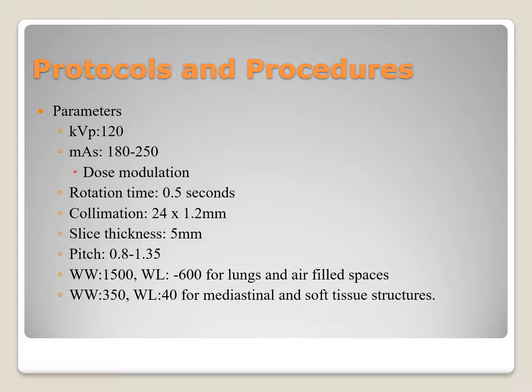General parameters are listed for viewing. Of course, adjustments would be made depending on patient size, although dose modulation comes in handy for this purpose. Modulation equates to automatic exposure control, or AEC, which is done by controlling tube current. It's performed by 3 methods: patient size AEC, Z-axis AEC, and rotational AEC. According to pubs.org, the most recent MDCT software makes use of a combination of these methods.